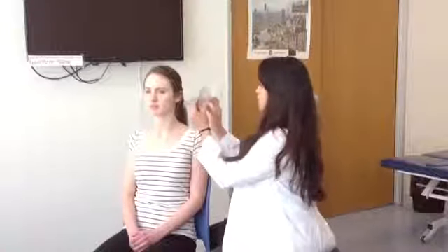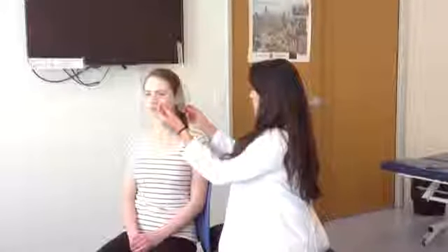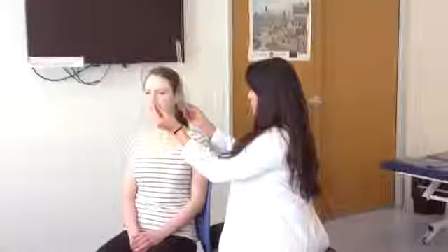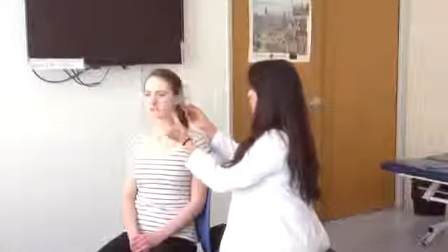Okay, so I want to make sure that you can go through both flexion and extension. So can you look down at the floor? Good. And can you look up towards the ceiling? Good. All right, so go ahead and look straight ahead, nice and tall. I'm going to be putting this close to your head again. So I'm putting the axis right beside your ear. This stationary arm is perpendicular to the floor, and this movable arm is right at the inferior border of your nose. And good, you are at 0.